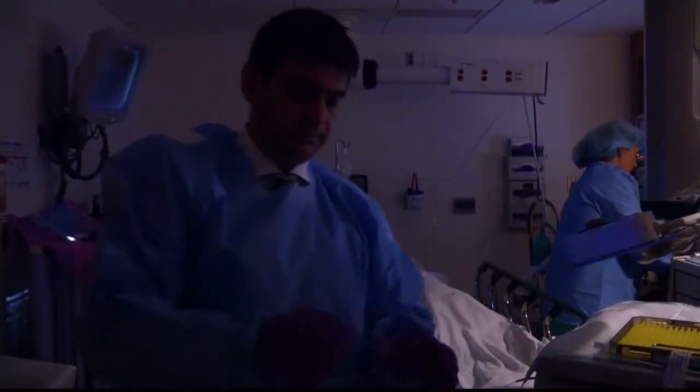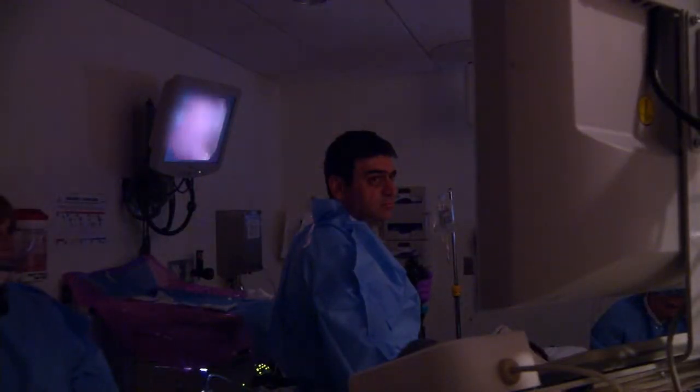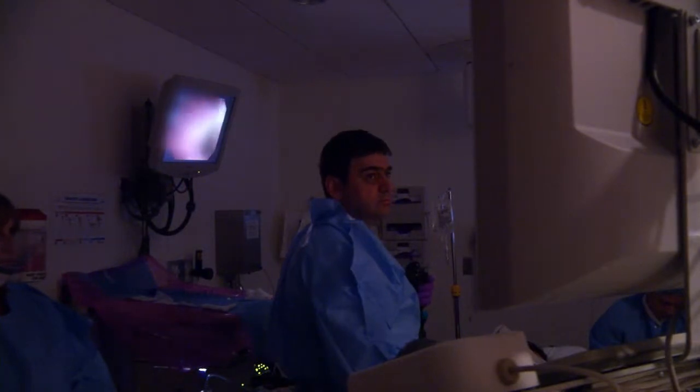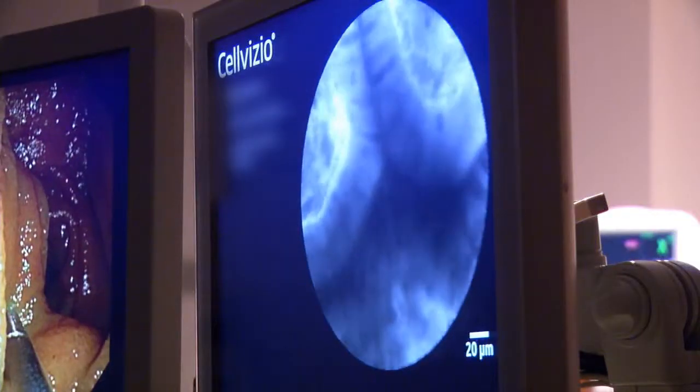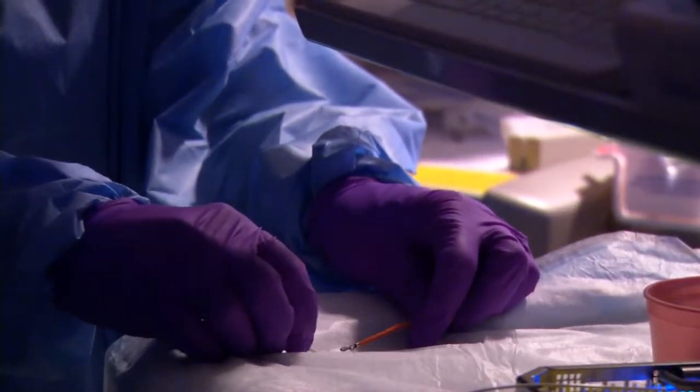But thanks to this tiny blue laser, that approach is changing. As if you're navigating a tiny microscope throughout the body, right? It's like those science fiction movies when they took a trip to the blood vessels. Dr. Razvan Arsenescu is an IBD specialist at the Ohio State University Wexner Medical Center and an expert in this laser technology. He says without making a cut, he can press this laser against the wall of the intestine and magnify it 1,000 times, and on the spot can determine if a biopsy is really necessary.